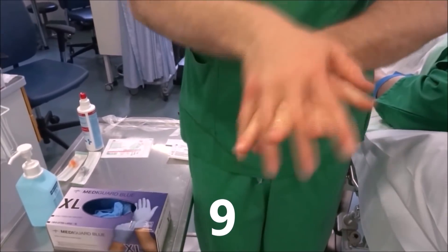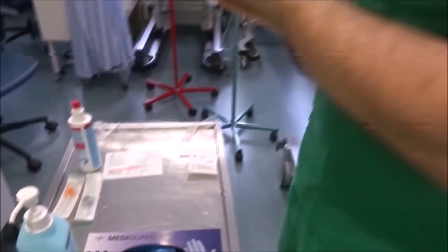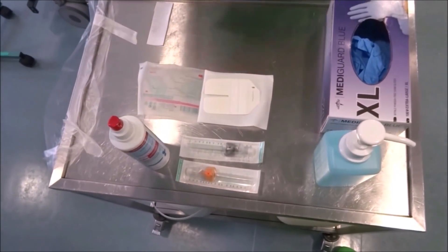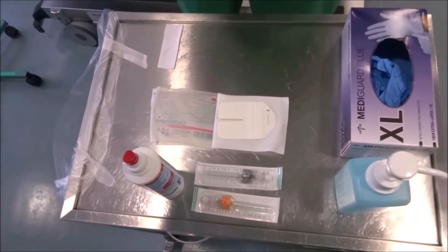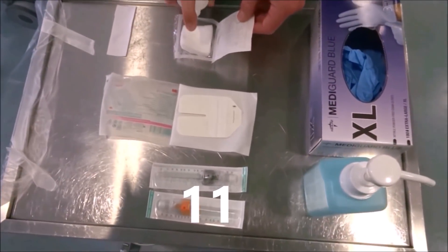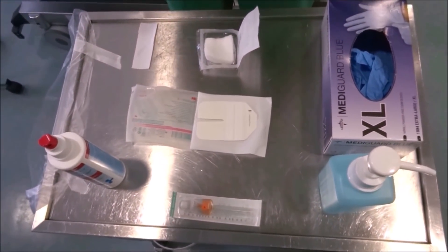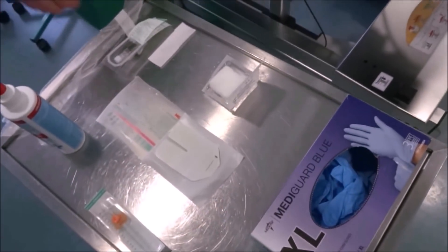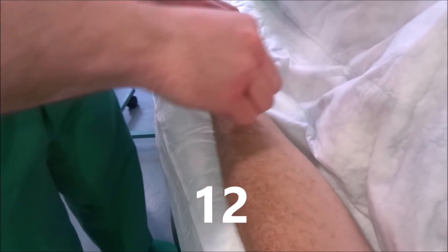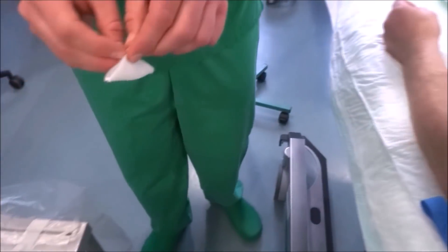After that, we carry out again a hygienic hand disinfection. As point ten, we prepare aseptically the required utensils for the venipuncture. As point eleven, we soak the compresses in the packaging with the antiseptic solution. Point twelve, we disinfect the puncture area thoroughly according to the screw technique and three times with different compresses.